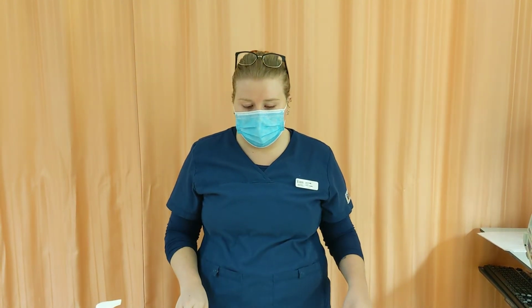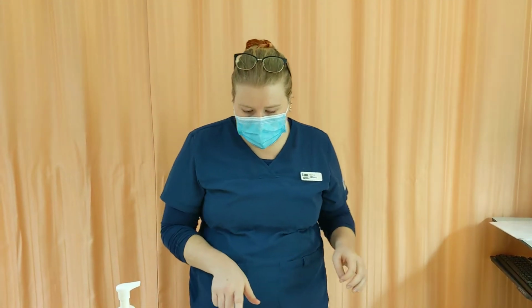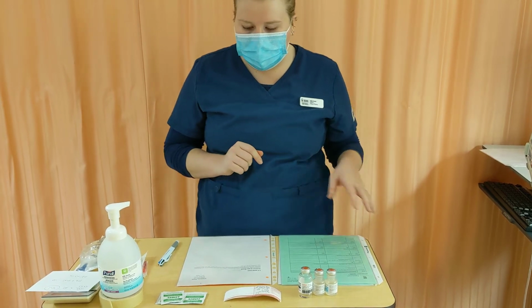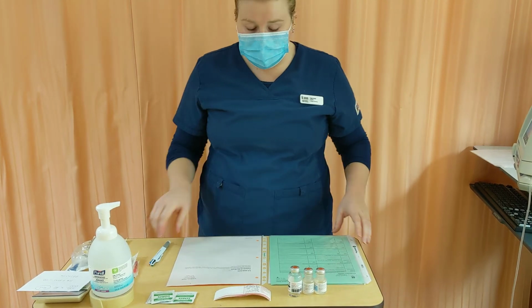Hi, my name is Purvis, and today I'm going to be demonstrating the administration of an IV piggyback medication. So the first thing I'm going to do is wash my hands, and then I'm going to go over my situation. My patient is Fiona Friedman. She's been admitted 3 days ago because she got scratched by her cat and has developed cellulitis, so we're going to be giving her Vancomycin today, which is an antibiotic.